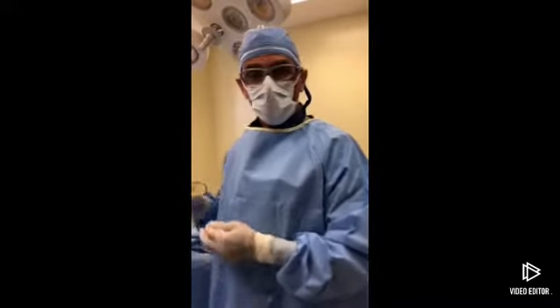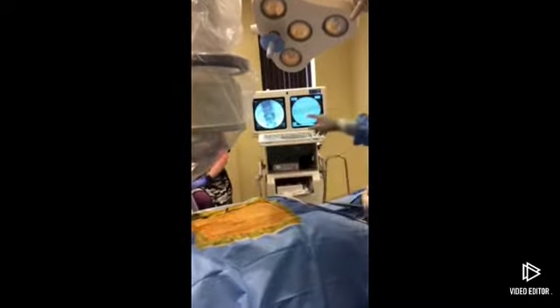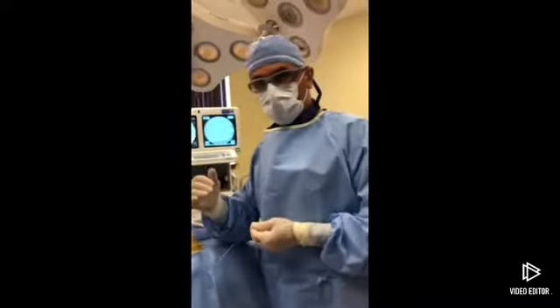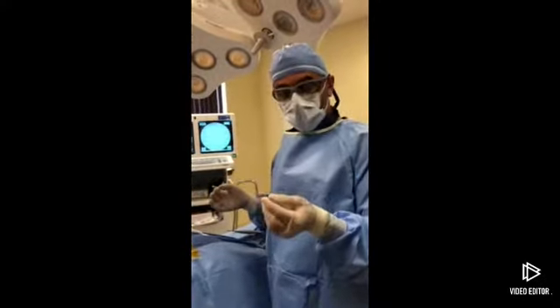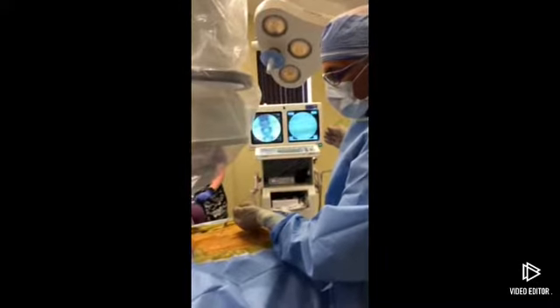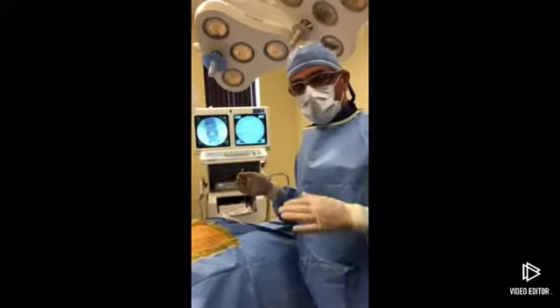Okay, so now at this point, audience, we have placed the needle into the epidural space, which is shown right here. You can also see on the x-ray screen that this is between her spinal vertebrae, in this case L1 and L2. What we're going to do is pass this wire, or spinal cord stimulator neuroelectrode, through the needle and have it go up the epidural space rostrally to approximately the T9 level. So we'll go ahead and do that now and show the end in a minute.